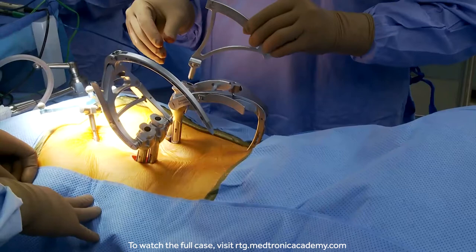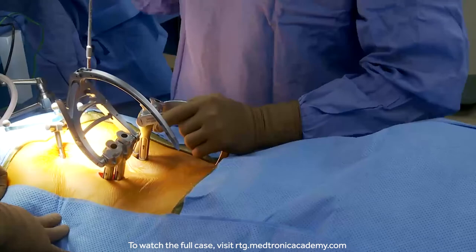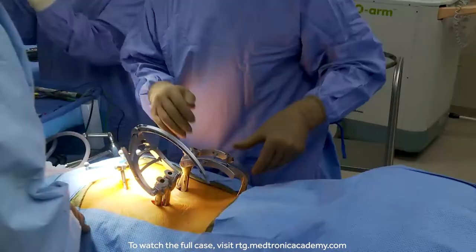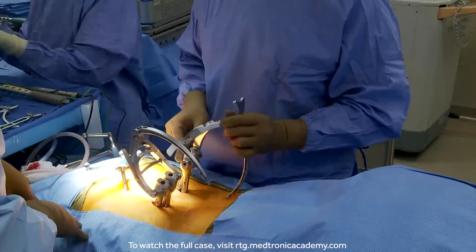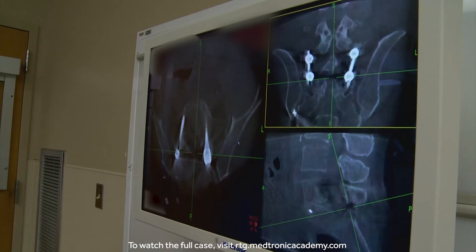So I can feel that rod, and I can hit it now there. And I can feel it hit there and fall off. So I know that we're in good position there. We then release the arc from the rod, separate the extenders, and pull them out. And so now we'll get an image, look at our screws, look at our graft, look at our decompression. We can look at all those things, and then we'll close.